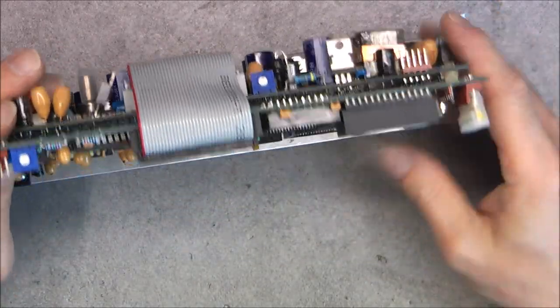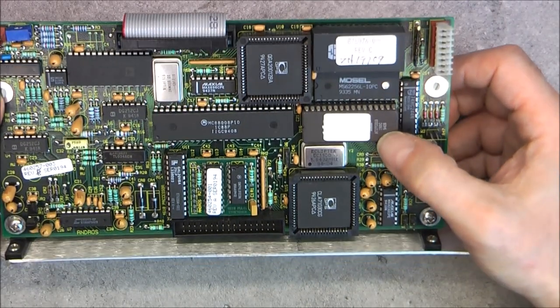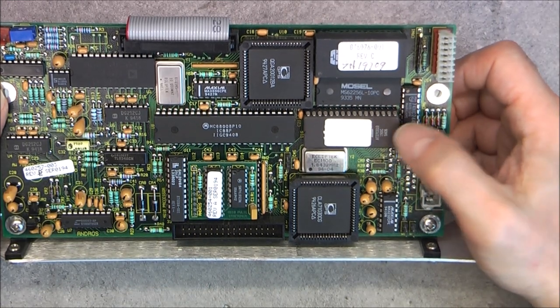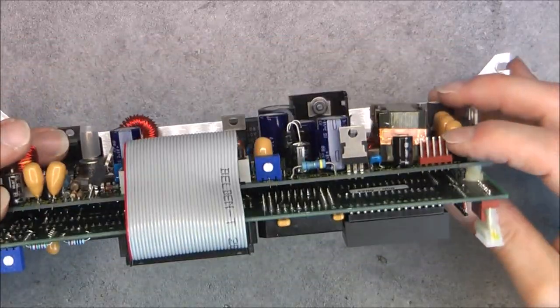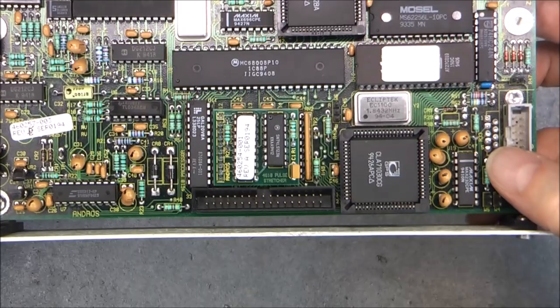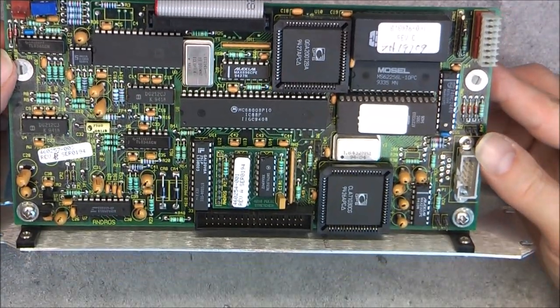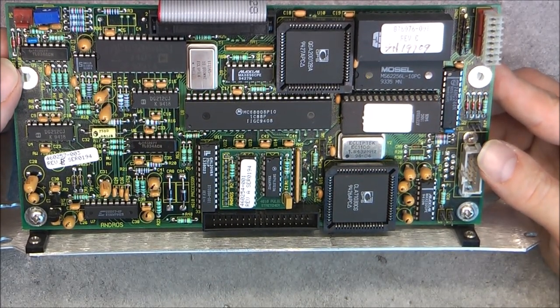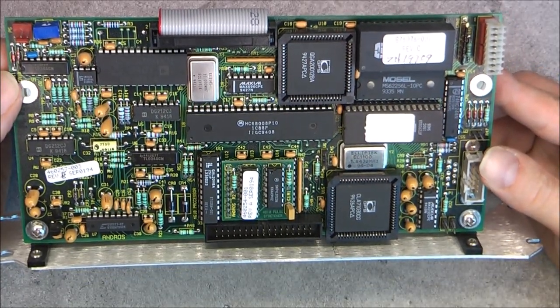One more Dallas thing with socket this time. And this might be 27C, so this might be a microcontroller. We have a quartz for it. Some board here where it is written pulse stretcher. So I do not know if it is a front end for the patient side, maybe. Quite interesting. A lot of crystals.